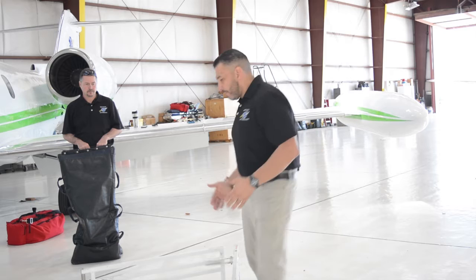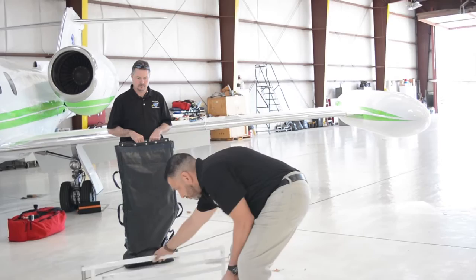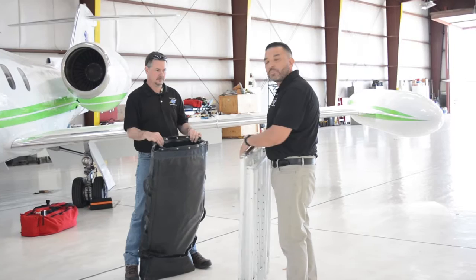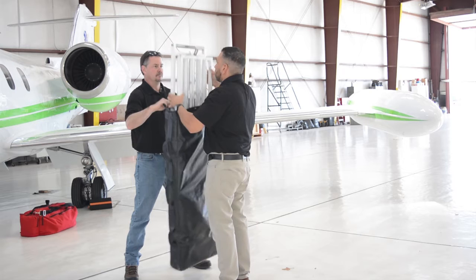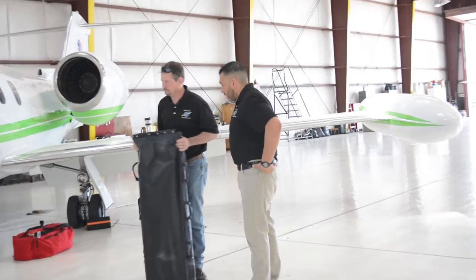Our 47 will actually, the ramp will stow in a compartment in the back, and we'll shoot some video on that. Otherwise, it's got to go inside the aft compartment or in the center aisle of the plane. Usually this is kind of a two-person job to get it properly loaded and back into the bag. That is it with the ramp operation.